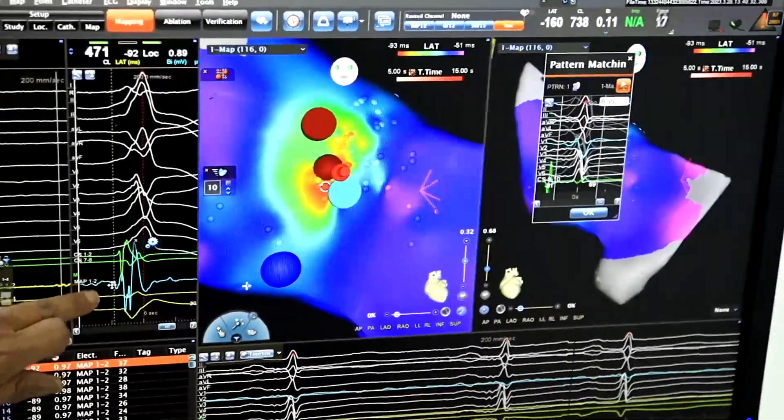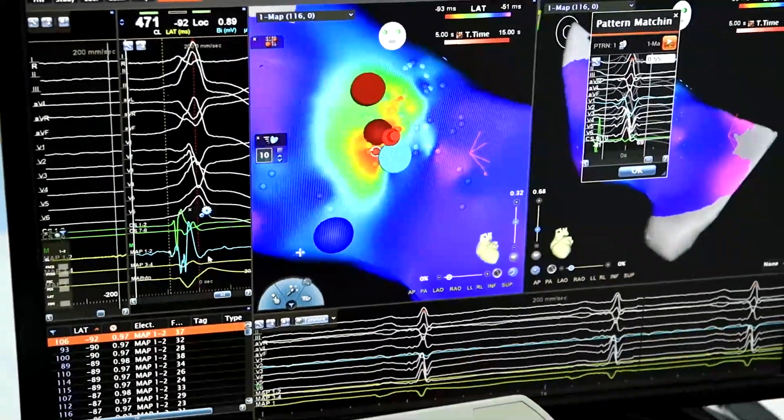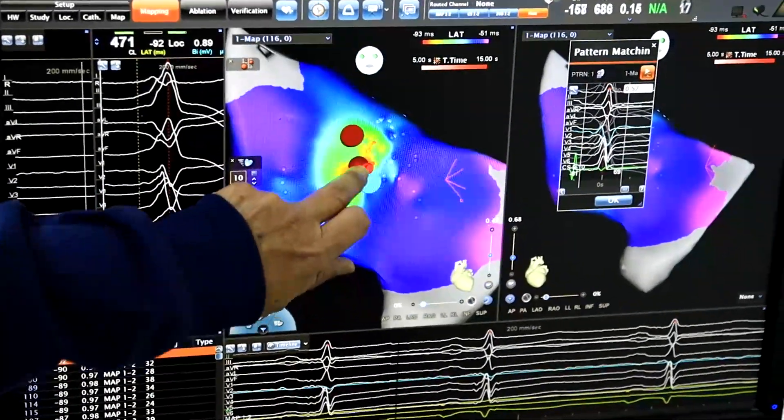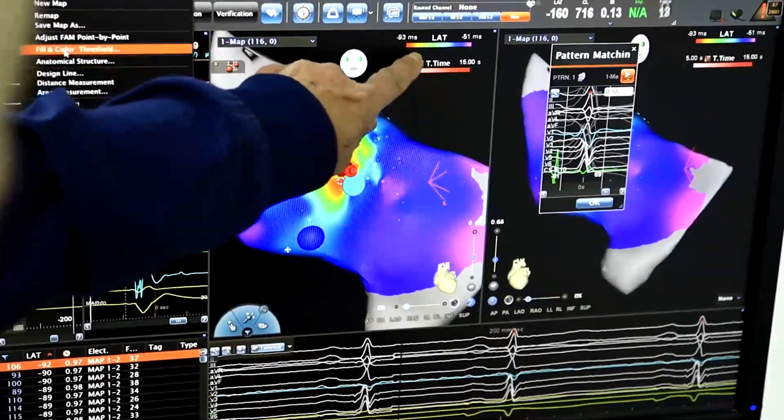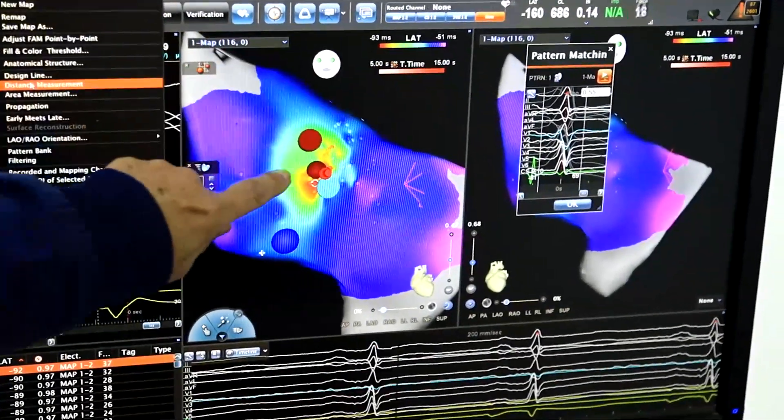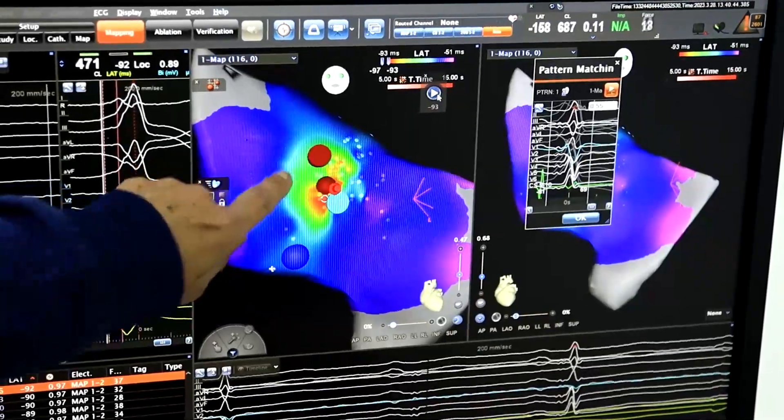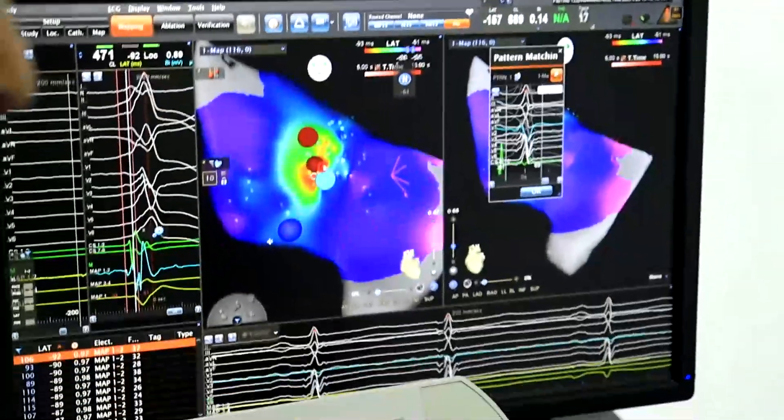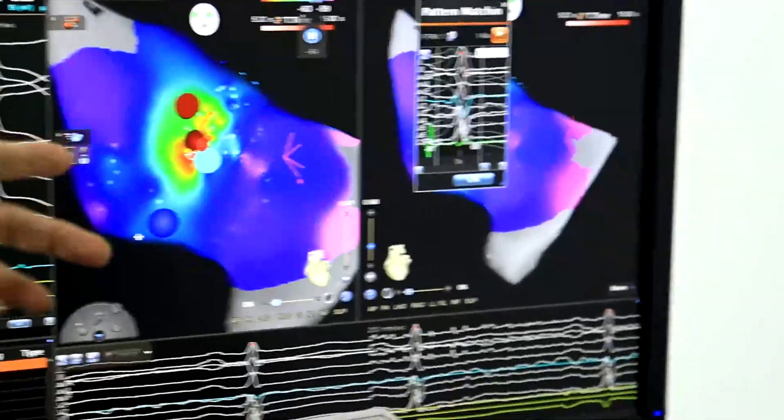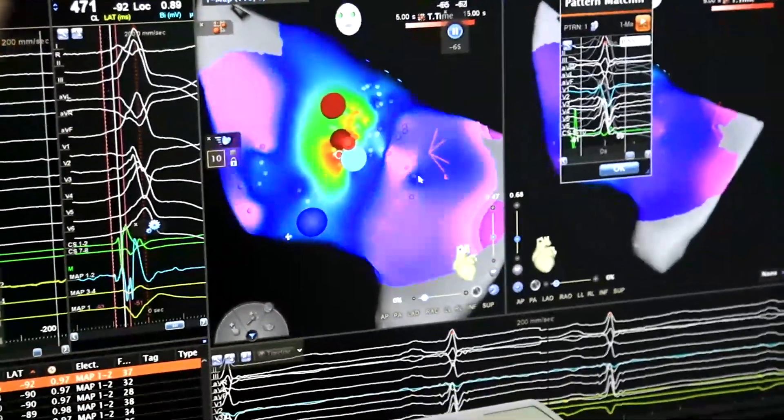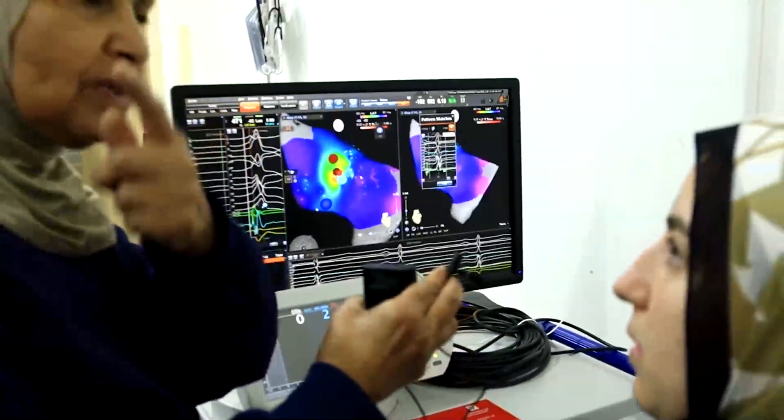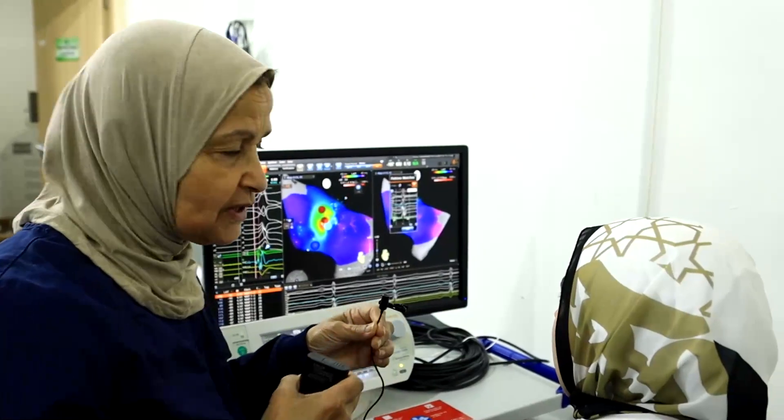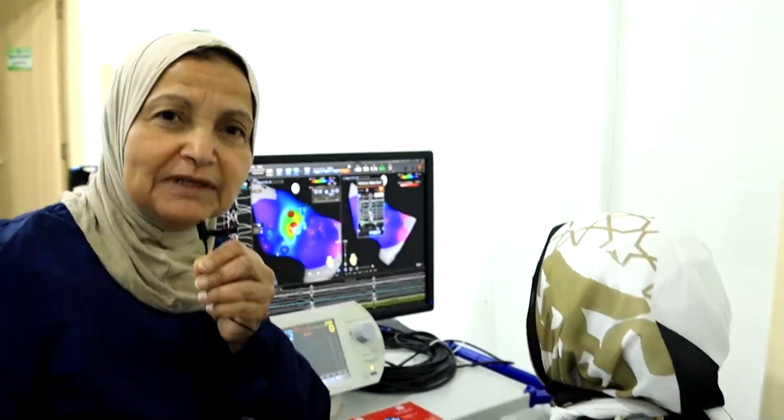Yeah, here is the potential which we saw in the electrical. Yes, and there's unipolar recording. And we have here the mapping. Red means early. This is the activation local activation time, exactly. And then for the propagation, the electricity goes focal, of course. Yes, so we didn't need to map too many areas, only concise. Yes, from the surface ECG to the intracardiac to the 3D, we updated this after 30 minutes. They were all compatible. And Ramadan Kareem.